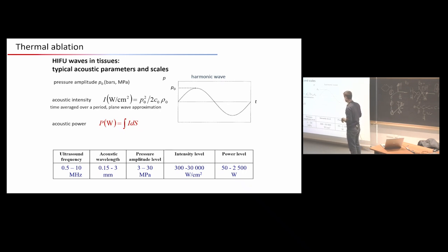So that gives you a range of values. If you're not familiar with ultrasound, it's quite difficult to explain, but this is about 10 times the pressure an ultrasound probe can give. And for intensity level, to give you an idea, for imaging, the level must be lower than 720 milliwatts per square centimeter. Here you see it's much higher.